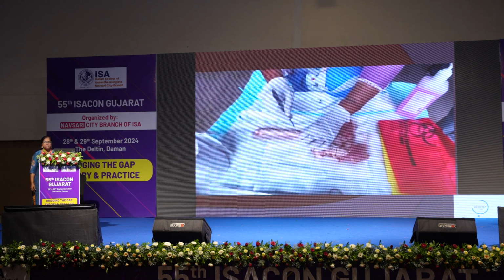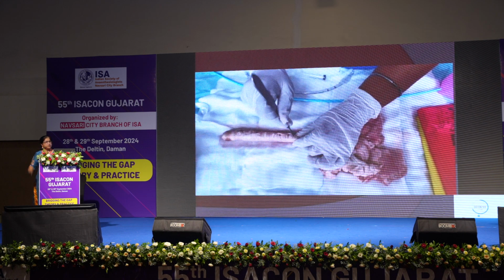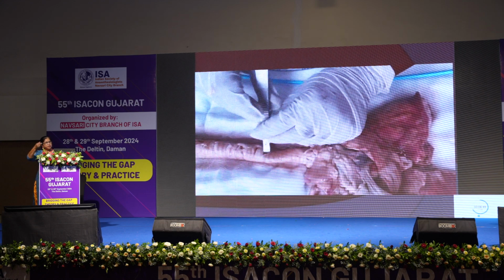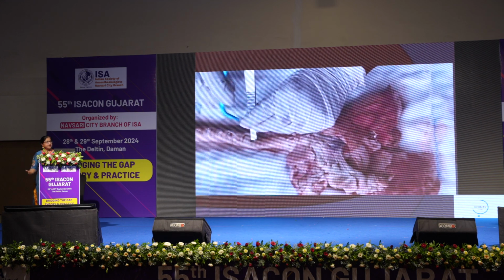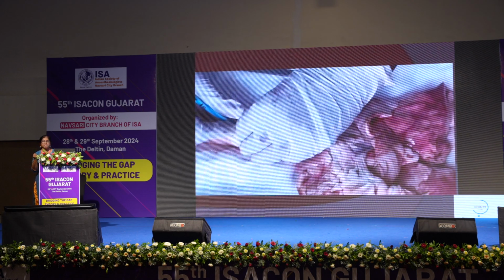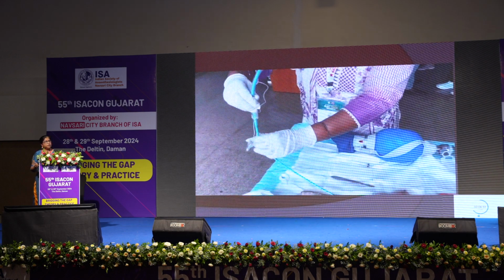Stab incision is completely perpendicular on the cricothyroid membrane, the lower part of the cricothyroid membrane. You have to make a straight stab incision and keep the shaft towards yourself. Then twist the knife, keep the sharp end in the caudal side. Introduce the bougie. As you can see, you have made a place. Once you turn the knife, you make place for the bougie to get in. Allow the bougie to get inside the trachea and simply slide over the tube.